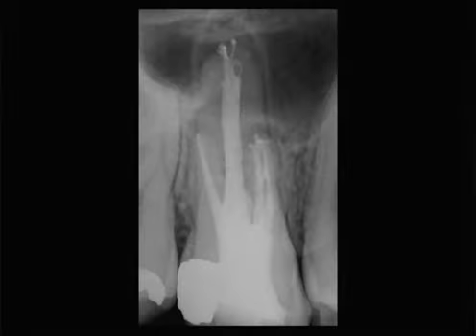In a referral-driven practice, it's quite normal to have patients present having had previous endodontic treatment and failure because of a missed canal. But I'd like to share a case with you that I did some years ago where I missed a canal. Notice this radiograph of a maxillary right first molar and the palatal root is failing. I decided to retreat this case non-surgically because at this point in time, I now had the clinical advantage of the microscope.